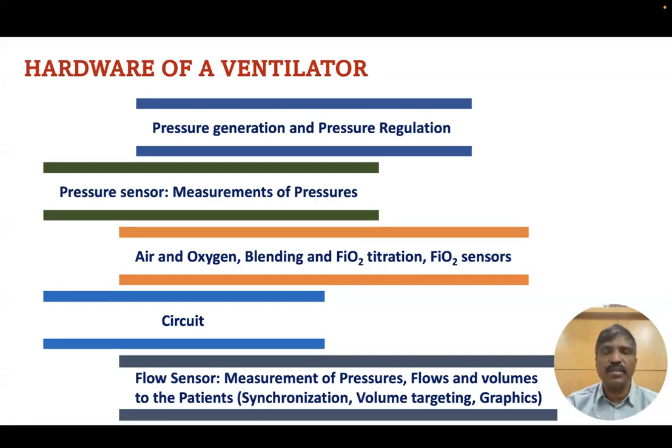The flow sensors are the important components of ventilators, which are used to set the modes, and the mode setting is basically based on how you trigger the ventilation, and how you terminate the inspiration. So the details of this hardware we'll learn in the subsequent slides.